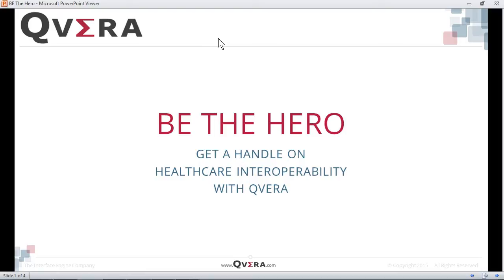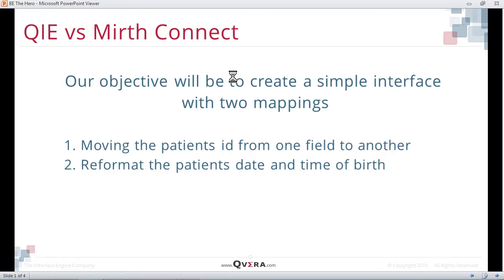This video will compare the usability and ease of use between the Mirth Connect and QIE interface engines. Our objective will be to create a simple interface with two mappings: moving the patient's ID from one field to another, and reformatting the patient's date and time of birth.